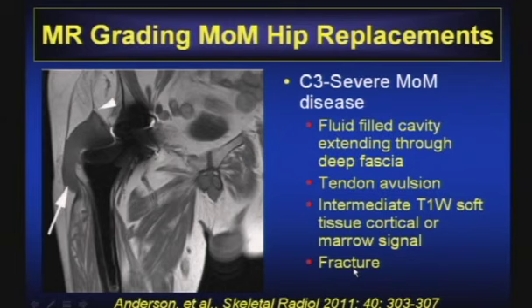Okay, there's been a huge recall by DePuy. What that recall has involved for all these patients who have metal on metal total hip replacements is that they are to be surveyed by MRI for 5 years. There are hundreds of thousands of total metal on metal hip replacements floating around out there, and we've just started to scrape the surface in San Diego. So our surgeons are asking for more and more of these every single day. So imagine all these people being surveyed every year for 5 years.